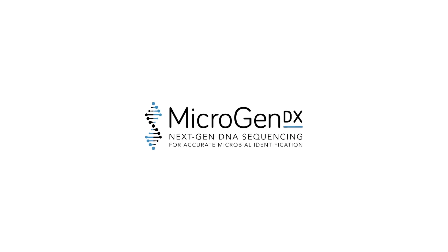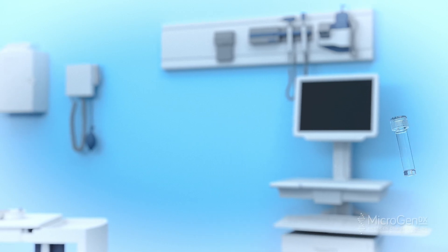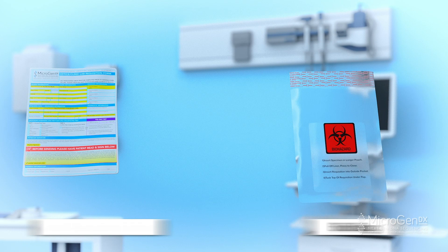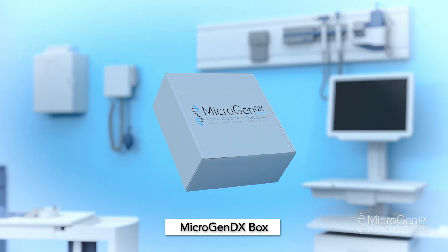MicrogenDX Collection Instructions: Nasal Sample Collection Method — Swab and Suction. The MicrogenDX Collection Kit includes one 2 mL vial, one nasal swab, a bio bag, a lab requisition form, and a MicrogenDX box.